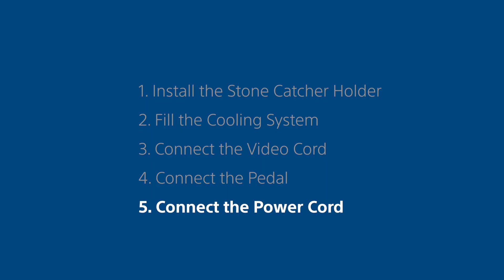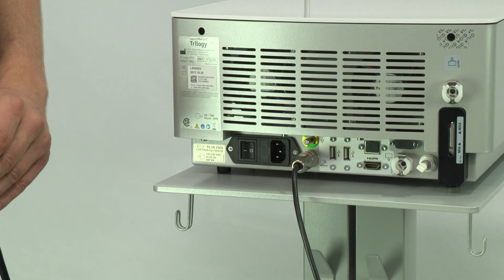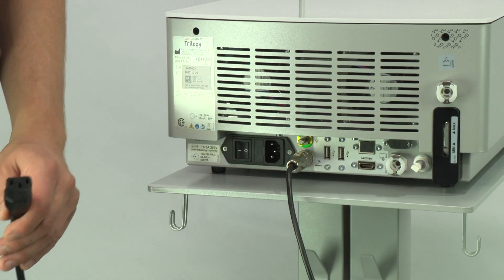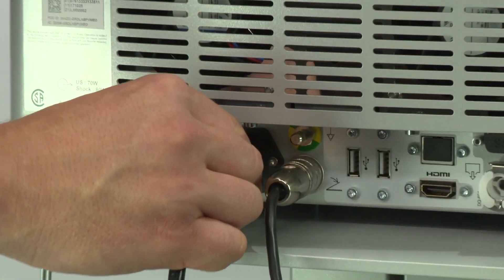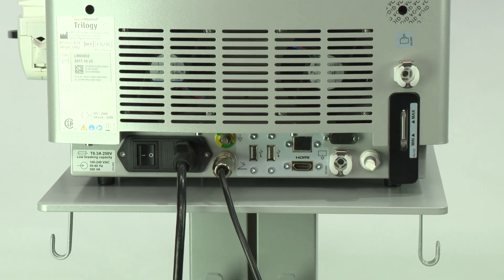Step 5. Connect the power cord. Connect the power cord to the power socket at the rear of the unit. The Swiss Lithoclast Trilogy is ready to be rolled into the operating room.